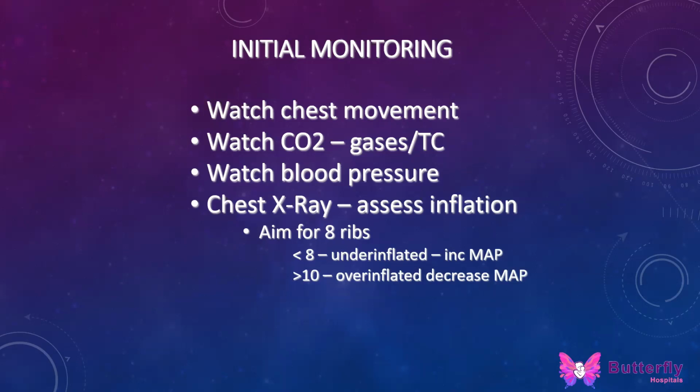So once you put the baby on high frequency oscillatory ventilation, it gives a clear instruction to the nursing staff and helps you to achieve adequate ventilation, preventing both hyperinflation and under-recruitment of the lungs. It's important to watch the chest movement. For example, if there is a loss in the wiggle of the chest, that tells you there may be an ET tube blockage or ET tube slippage, and the baby can start de-recruiting.